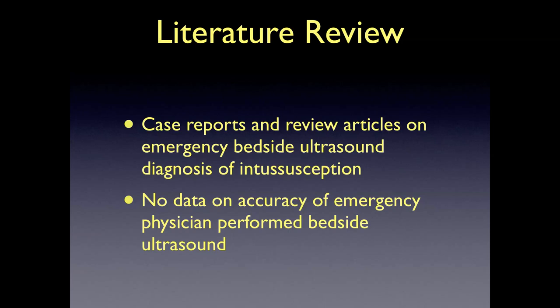In the emergency medicine literature, there have been case reports and review articles published on emergency bedside ultrasound diagnosis of pediatric intussusception. However, so far there has not been any published clinical trial on the accuracy of emergency physician performed bedside ultrasound in the diagnosis of intussusception in children.